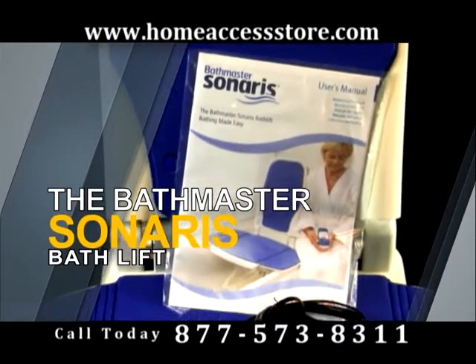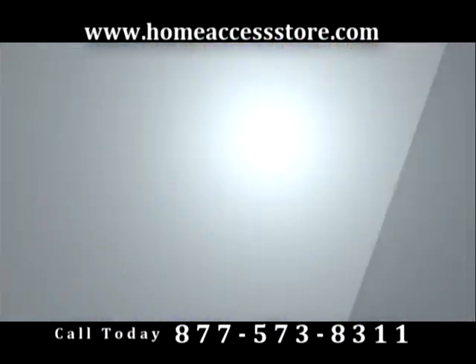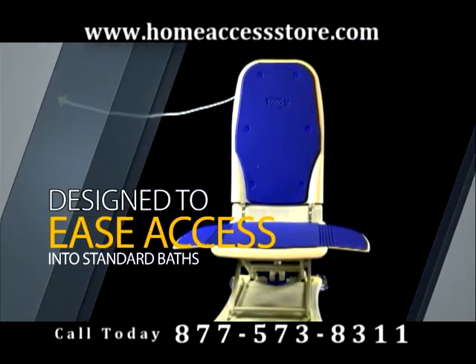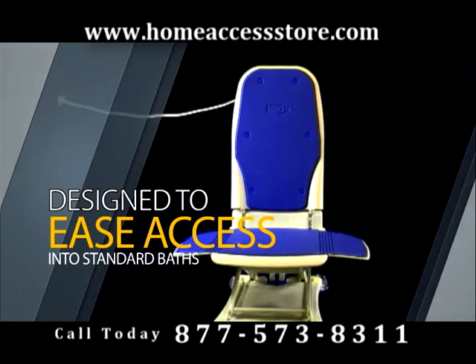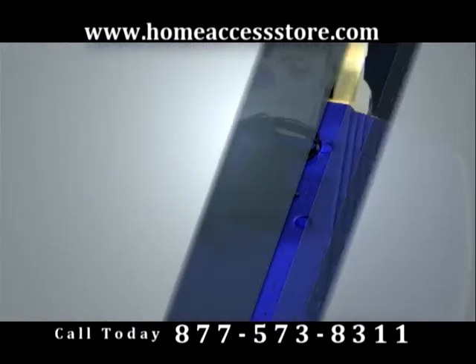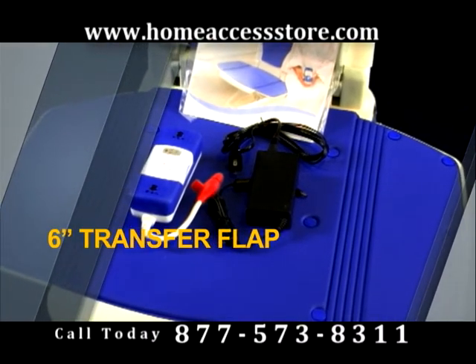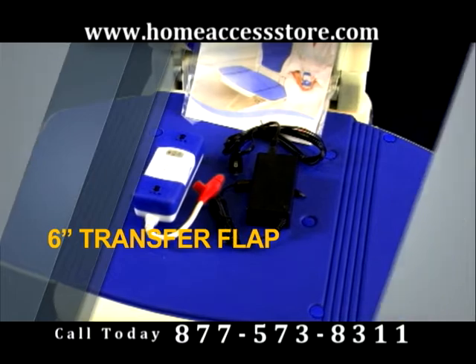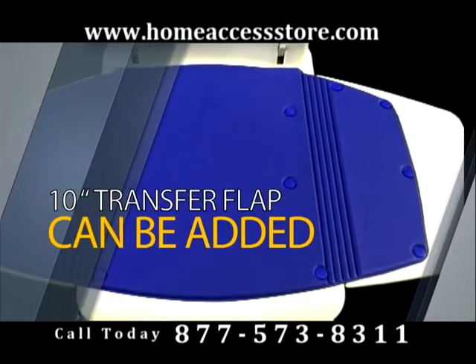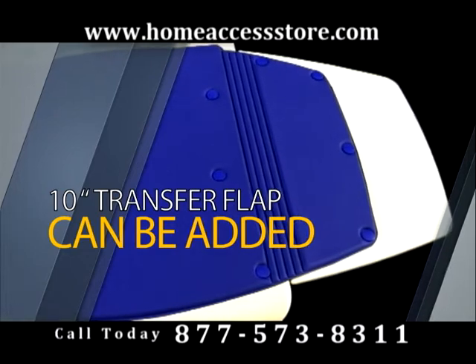The Bathmaster Sonaris Bath Lift is the ideal choice for mobility and comfort. This unique bath lift is designed to ease access into standard baths or even larger style garden tubs. A 6-inch transfer flap comes as a standard aid for your safety and support. For larger garden style tubs, a 10-inch transfer flap can be added to accommodate even more aid for a larger setting.